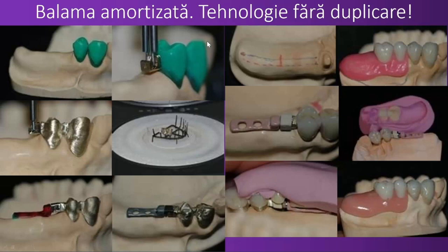So they remove like 1 millimeter from there, then they know exactly, okay, at the end, after I place 1 millimeter of ceramic, I will have this labial side as I modeled it initially, right? They see better if they do the full anatomic modeling. So you see, this is glued there, I mean fixed in wax. Yeah, this is very complicated, but you see, this is the metal one of the hinge. It's a technology without duplication.